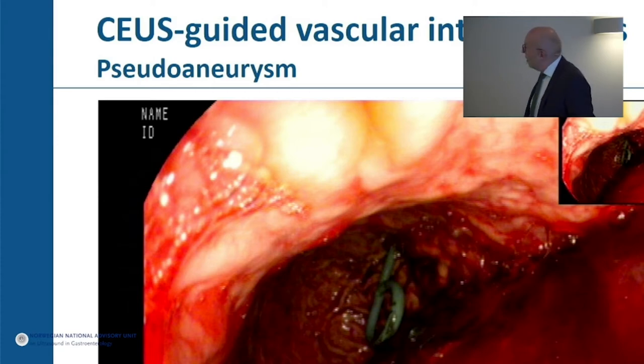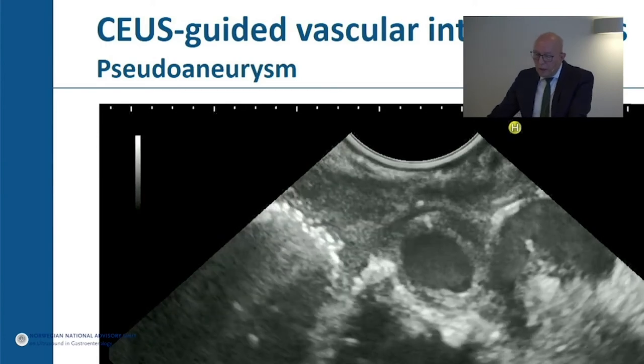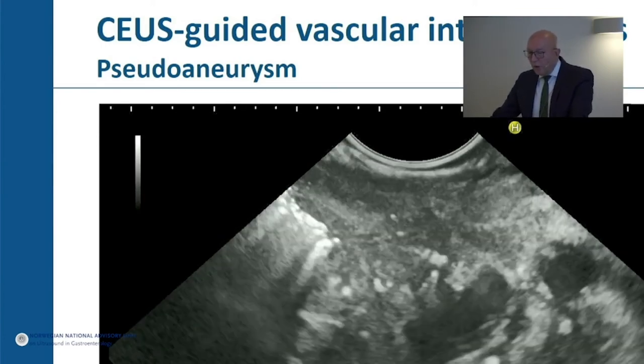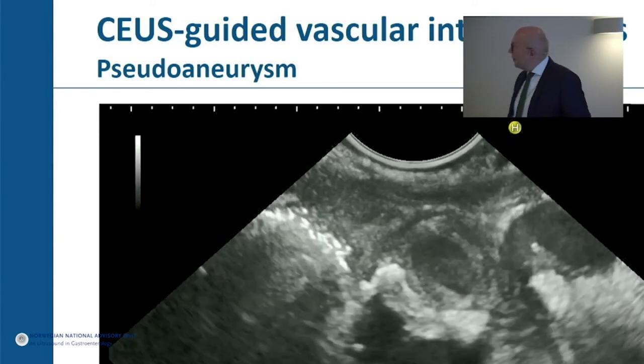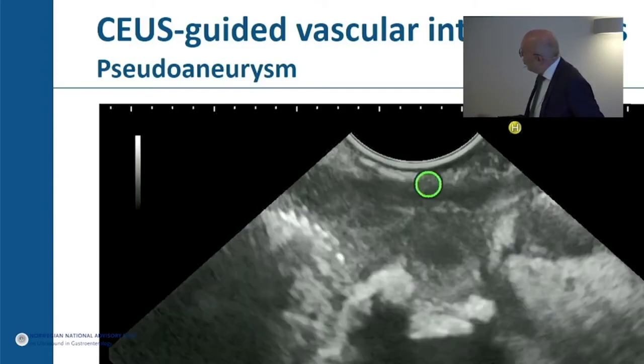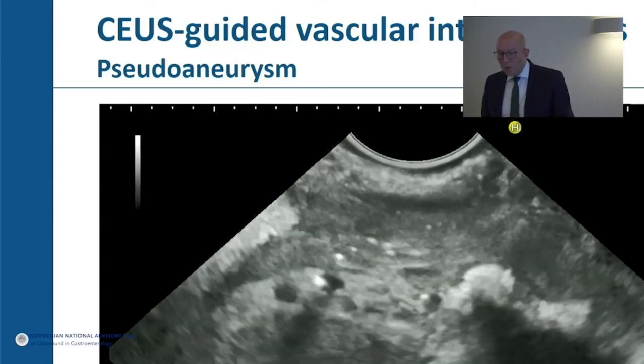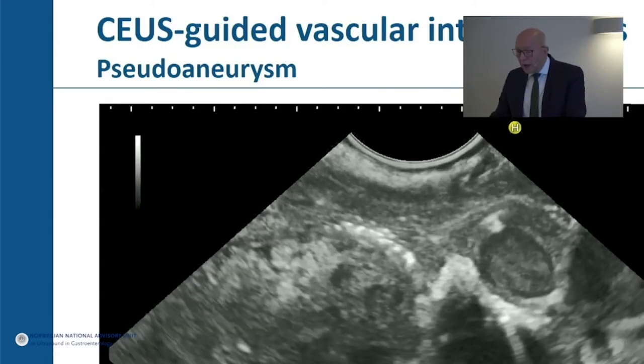Some hours, I think 10 hours, after this procedure, the patient developed a severe gastrointestinal bleeding. You see the drainage inside and the stomach is full of blood, and the patient was in shock. We stabilized the patient, and in the morning we performed endoscopic ultrasound. Here is a residual abscess with drainage, and here is a source of bleeding, which is a small pseudoaneurysm of the splenic artery.